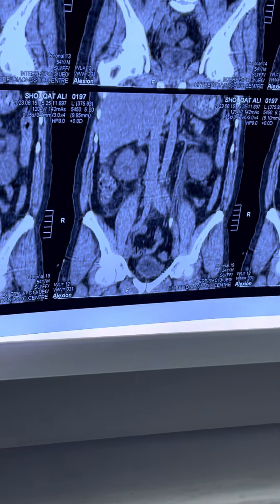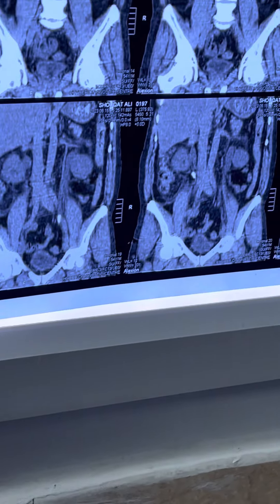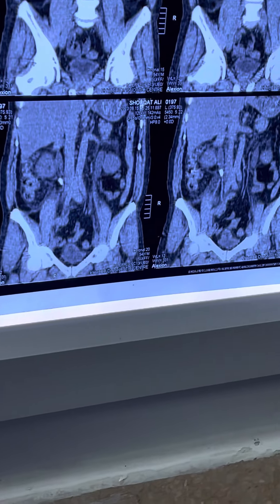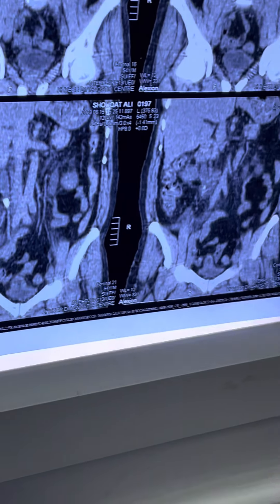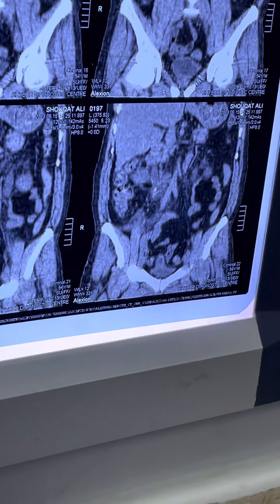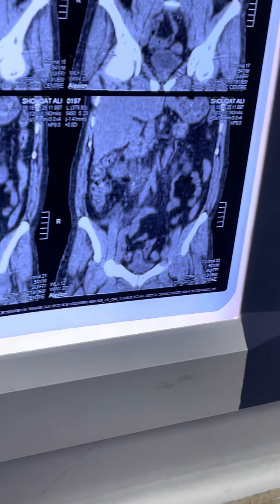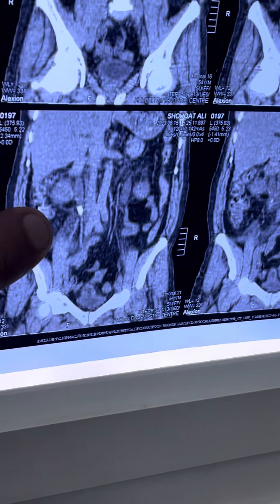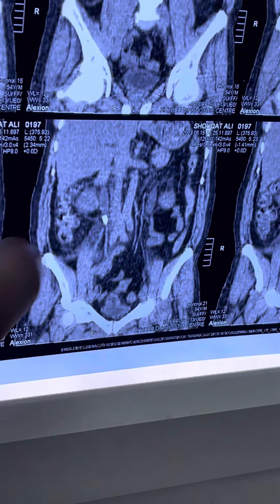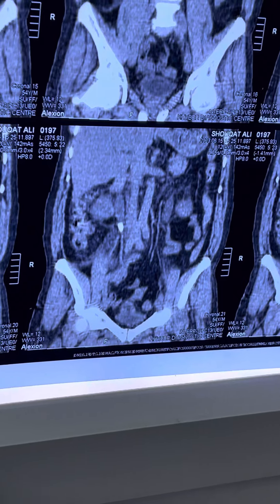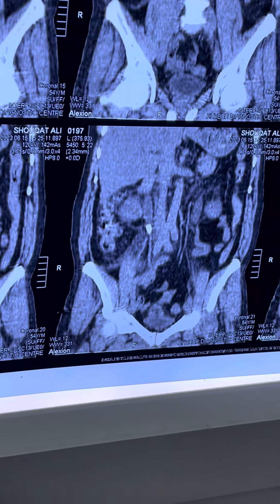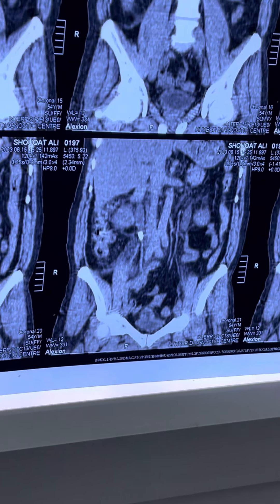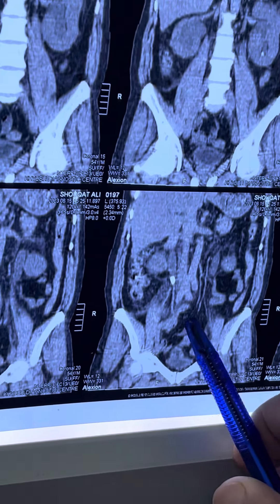Further plan for this patient should be bilateral stenting or bilateral URS. This is a typical case where the stone is causing proximal dilation and distal collapse.